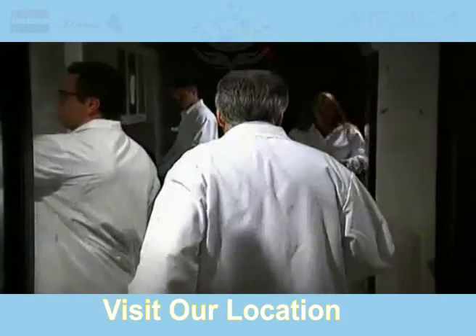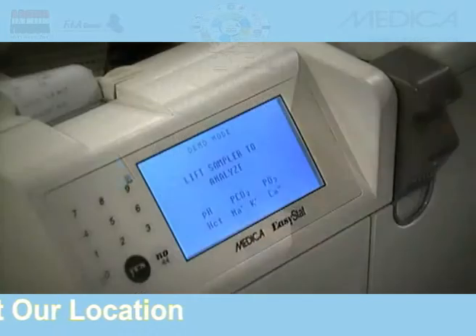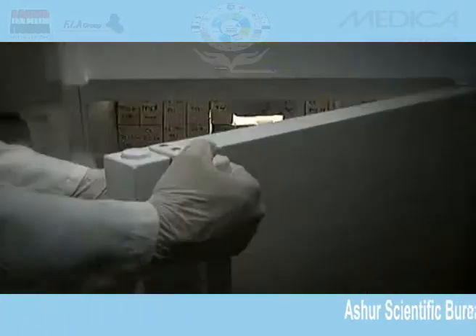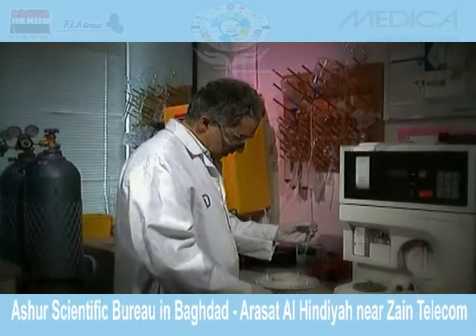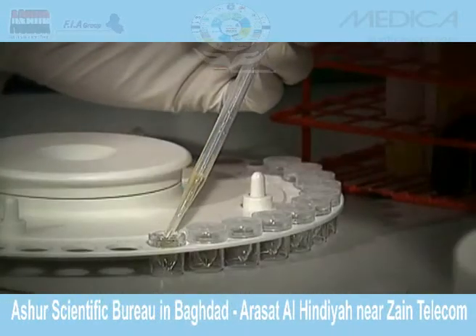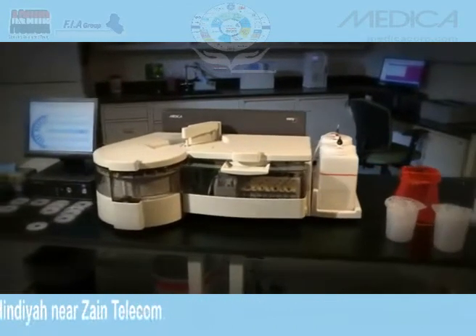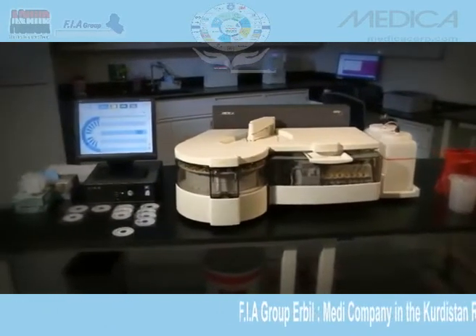In today's busy laboratory environment, it's becoming increasingly important to find ways to maximize efficiency while still ensuring quality. Clinicians and administrators must continually increase the quality of patient care while reducing costs and maximizing throughput. Let Medica's EZRA Clinical Chemistry Analyzer be your complete solution.